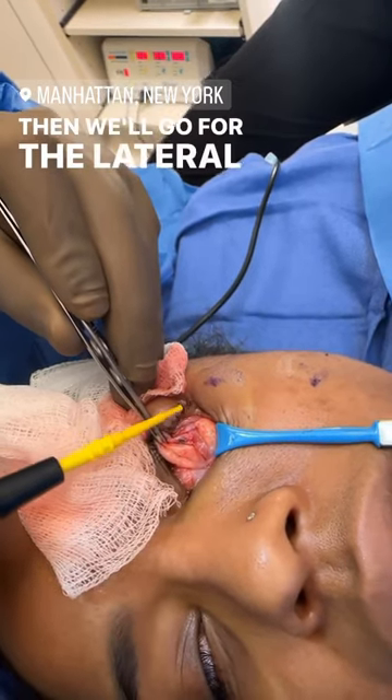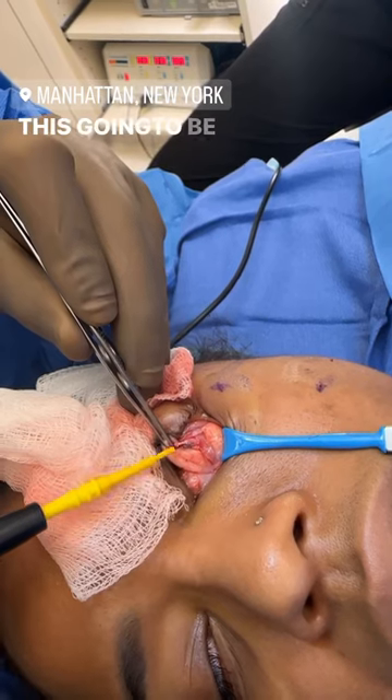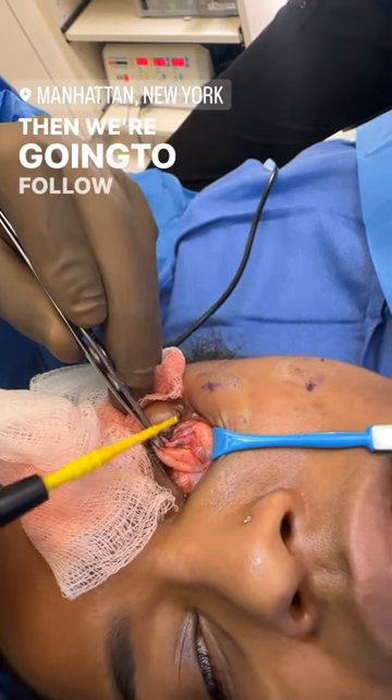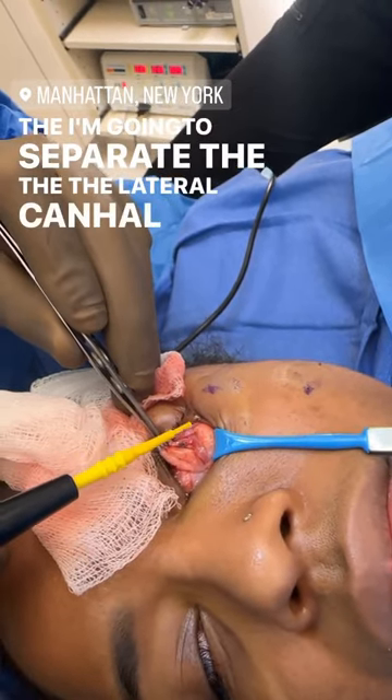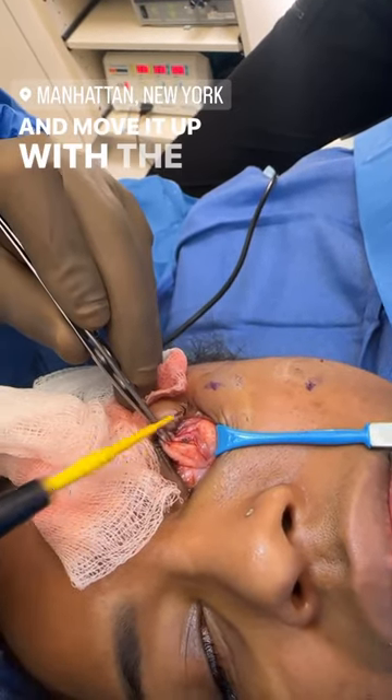Then we'll go for the lateral fat pad. This is wonderful — this is going to be a beautiful case. Then we're going to follow that with the Fox Eye Lift, where I'm going to separate the lateral canthal tendon and move it up with a cantopexy.